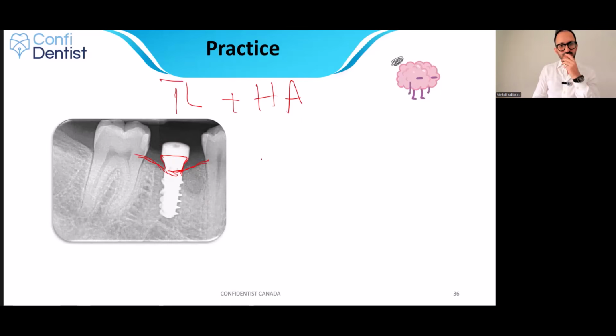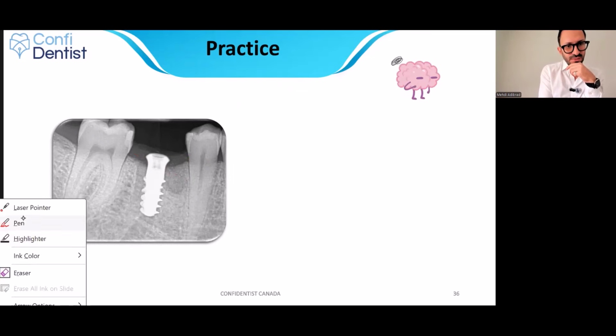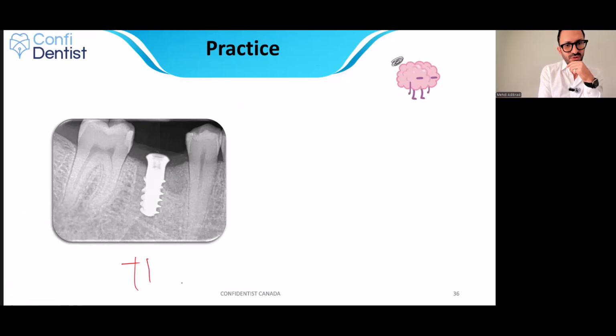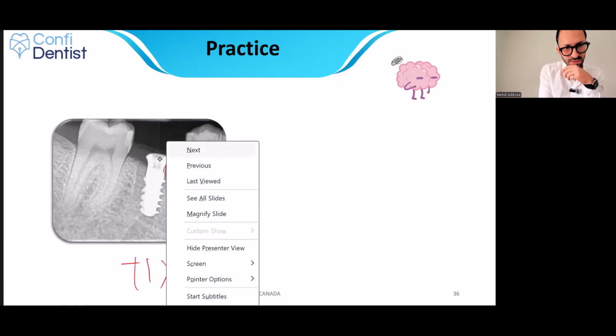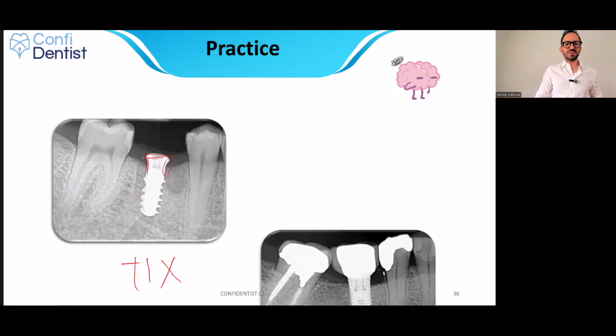This is a case I place immediately after tooth extraction. This is before the attachment of the healing cap. So you can see the implant. Implant is TLX by Straumann. Pay attention to this design. Okay. And this is a tissue level implant, no evidence of bone loss.